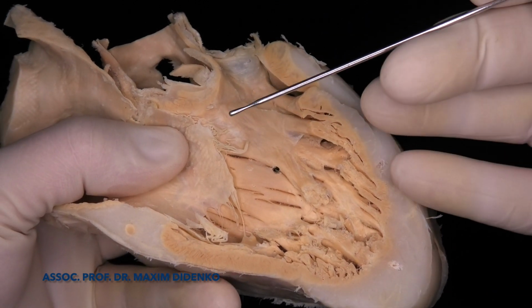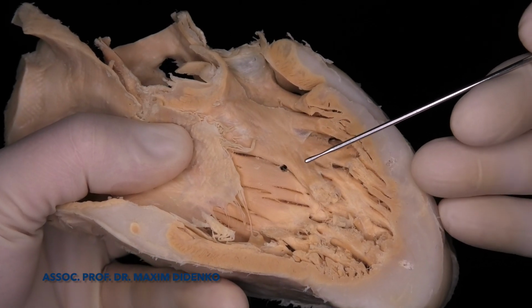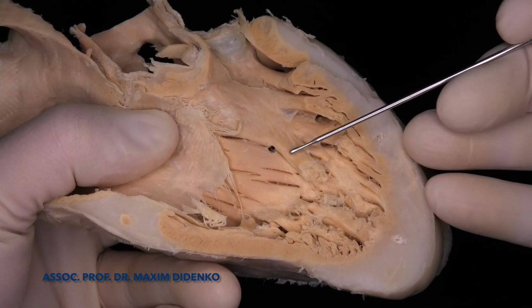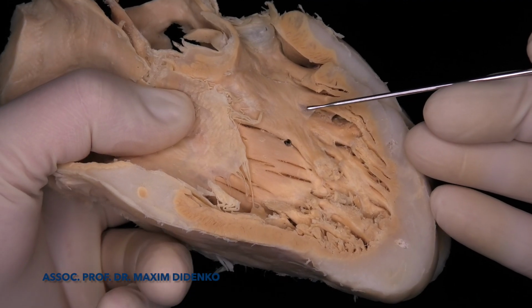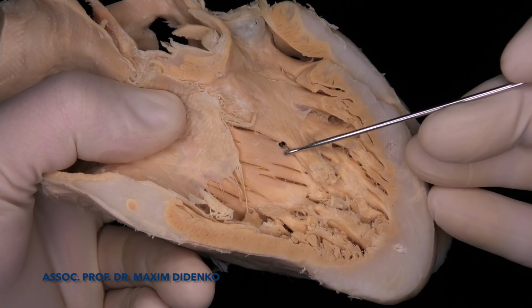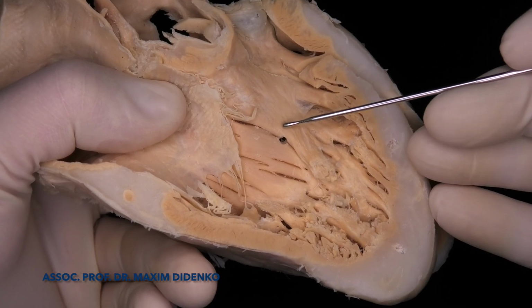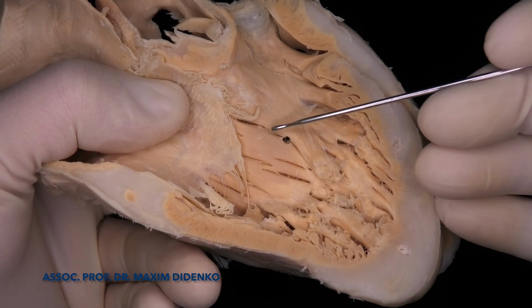The right bundle is going inside this structure towards the moderator band. Here the catheter partially covers it, so this is the moderator band. It is also important to understand that the first connection with the Purkinje fibers can be found here, in the border between the trabecula septomarginalis and the moderator band, in this area here.